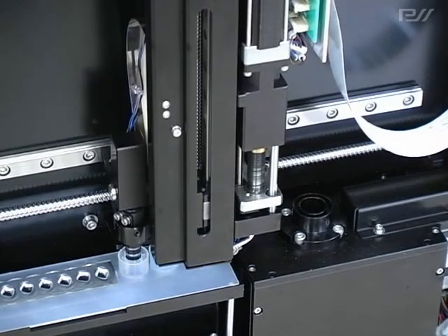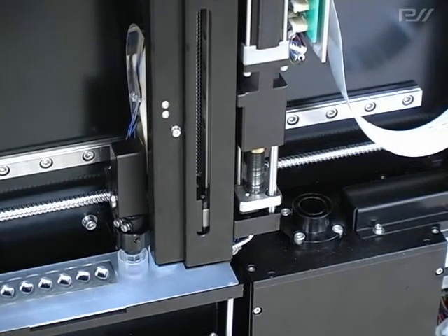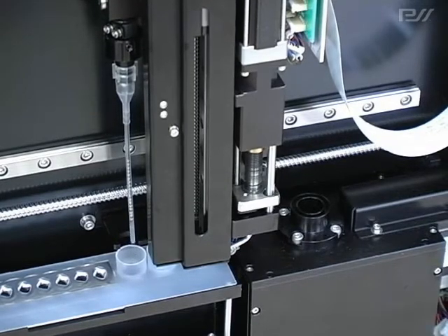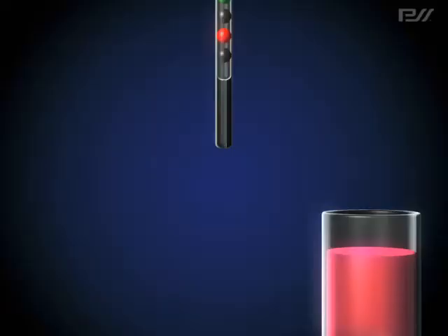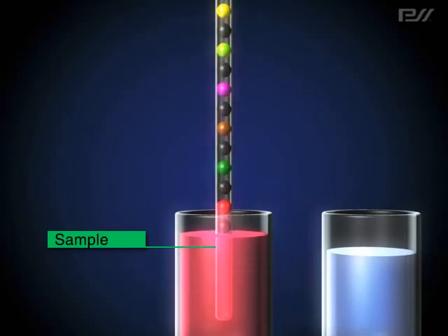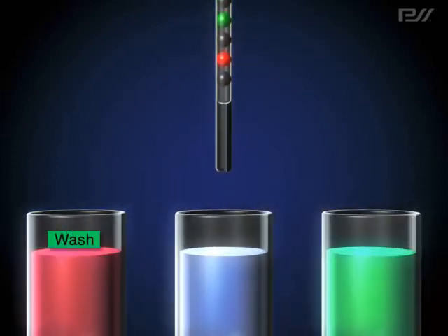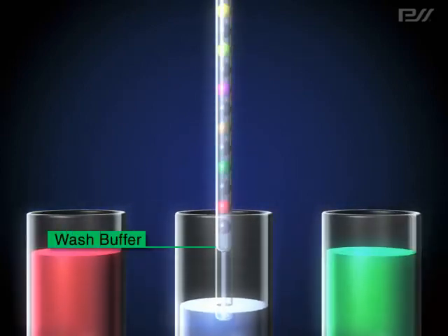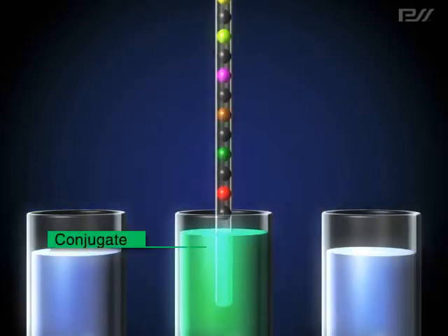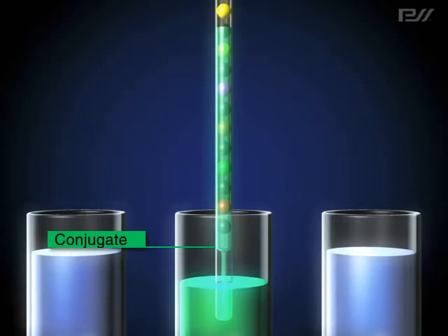First, Lubia picks up BIST. Then the nozzle which holds BIST moves to the sample well and aspirates the sample. Target antigens are captured by antibodies on the bead by repeated aspiration and dispensing. Next, BIST is moved to another well containing a washing solution, where the beads are washed with the same aspiration and dispensing actions. By repeating this process, non-reacting materials are removed from the bead surfaces.